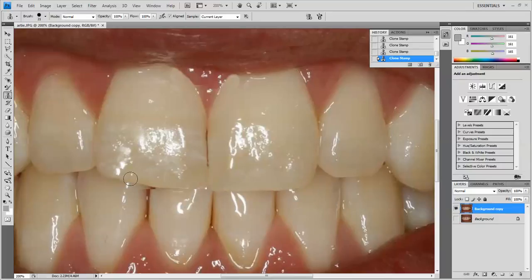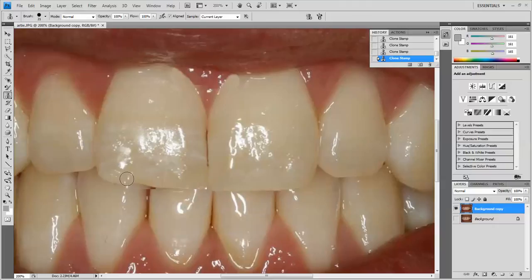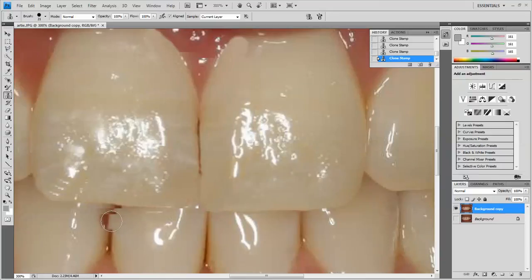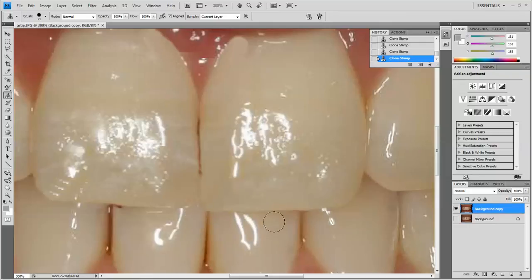A few other things you could do — if you wanted to bring this corner down, it looks a little short, so we could sample that and start clicking away. You can see if we really zoom in here, a few of the spots are off where we had dragged the tooth earlier. So if I wanted to sample that again and restore the interproximal areas, we can do that. If I want to clean up a little bit of this artificial noise right there, we can do it. I look a little off here, so I might take a bit and transfer that.